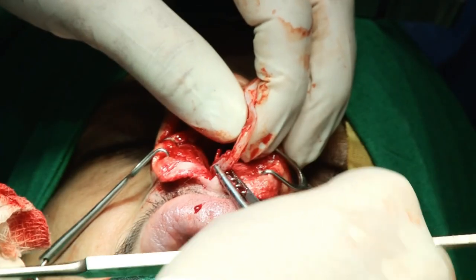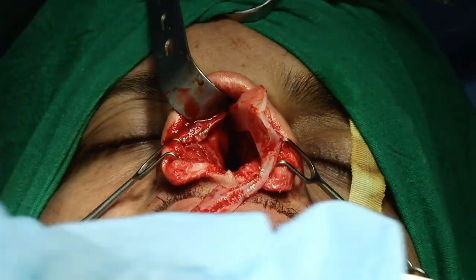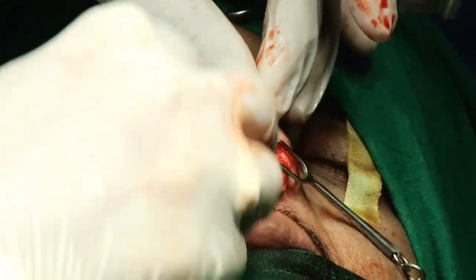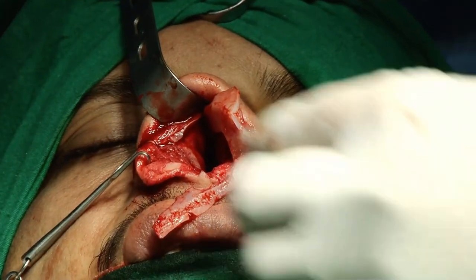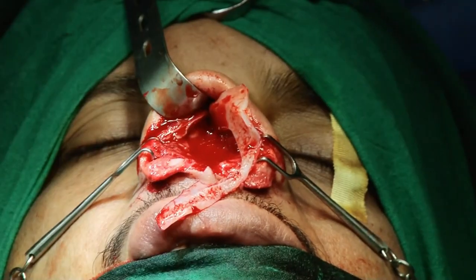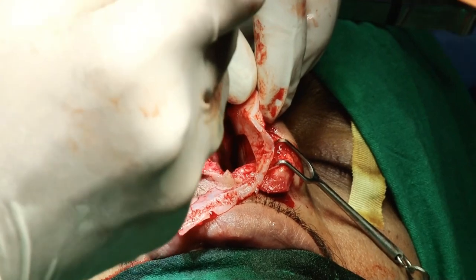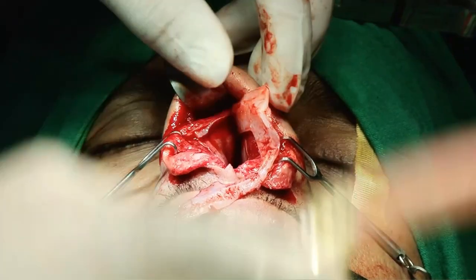So how badly the septum looks, this is the septum. The entire septum is buckled badly. Packing then, give me the packing. Yes, packing then, but septum. So this septum, whatever amount is deviated, we excise.